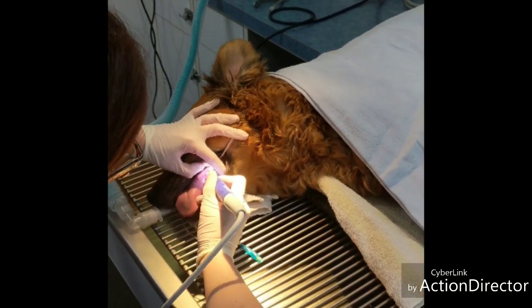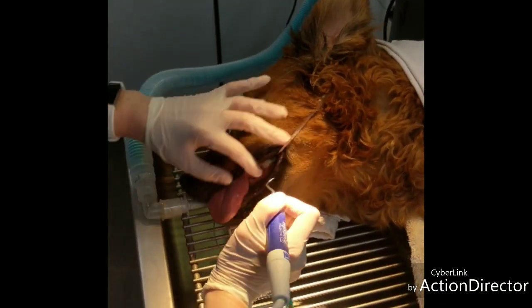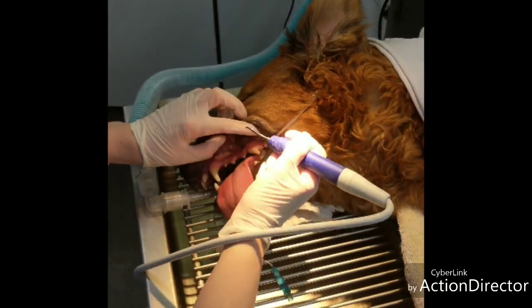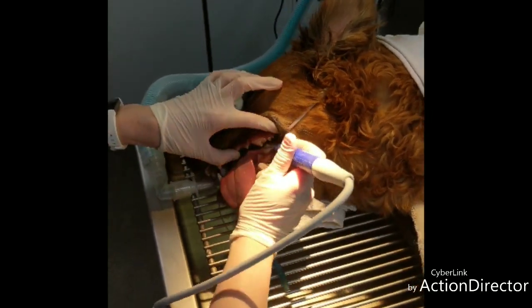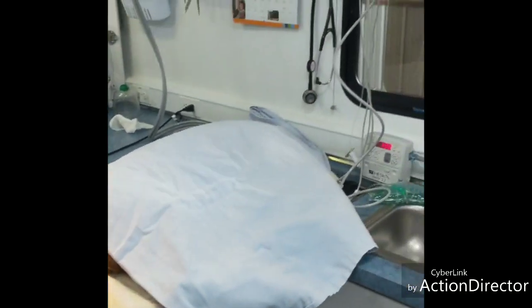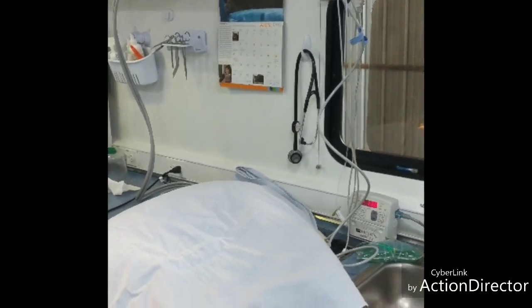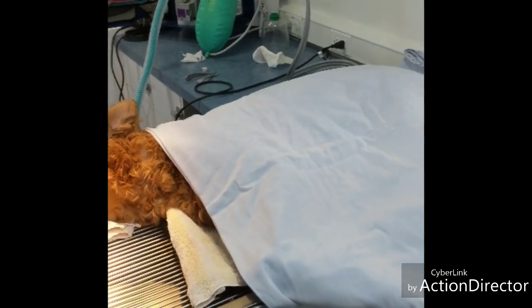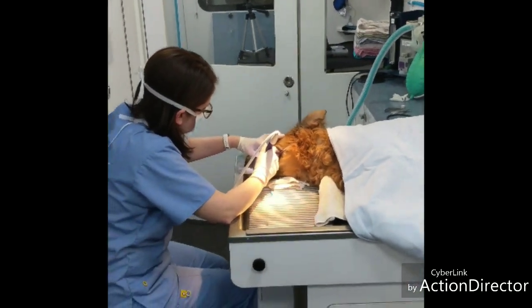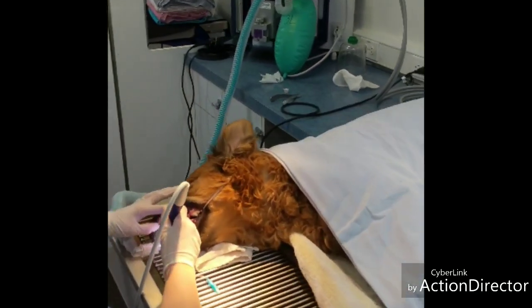She's already had her oral exam, where I went in and evaluated all of her oral structures, measured any pockets around her teeth, and made sure she didn't have any significant periodontal disease. While she's having her dental cleaning, she's being closely monitored. We monitor the heart rate, the respiratory rate, her blood pressure, her body temperature, her oxygenation. Make sure everything's stable. We record those vitals about every 10 minutes.